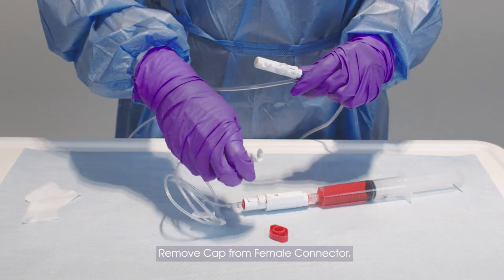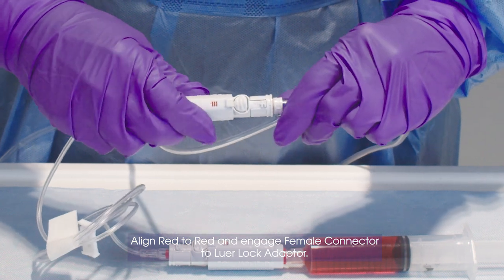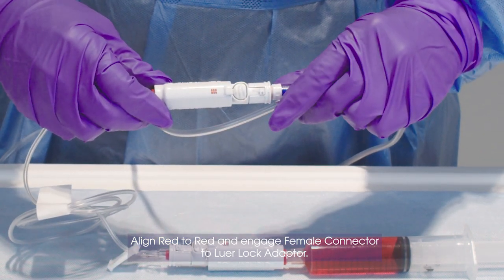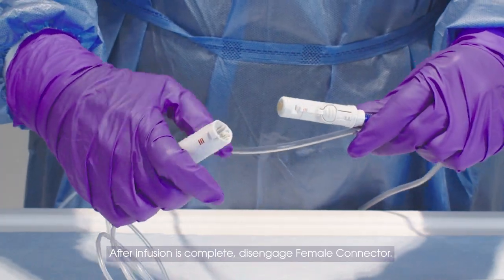Remove cap from female connector. Align red to red and engage female connector to lure lock adapter. After infusion is complete, disengage female connector.